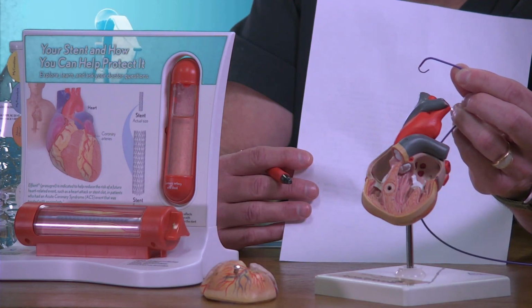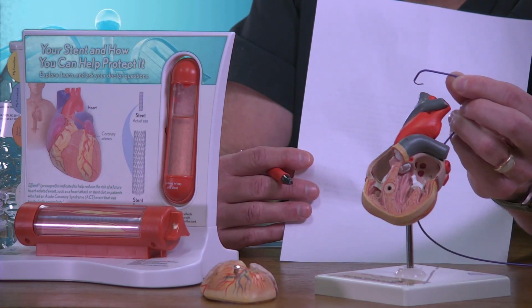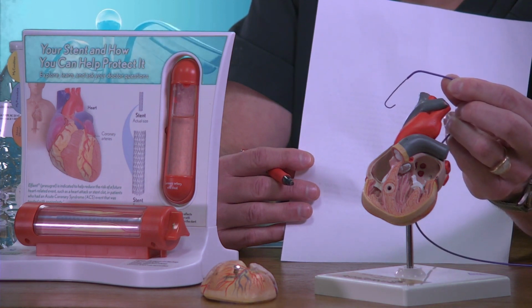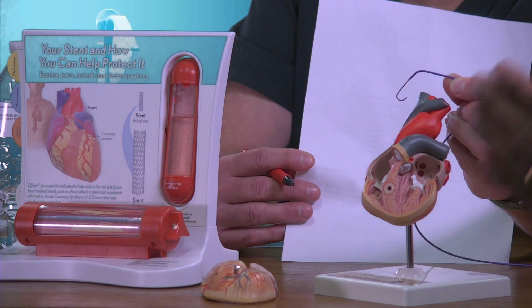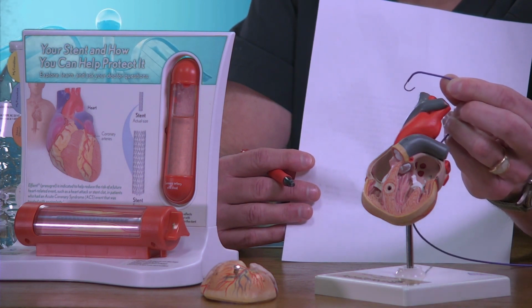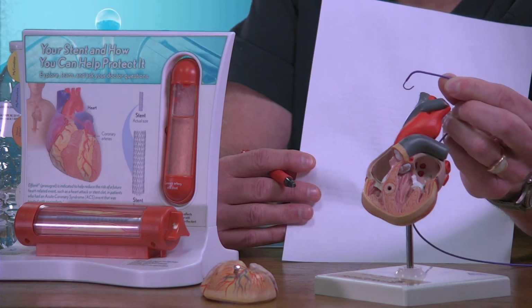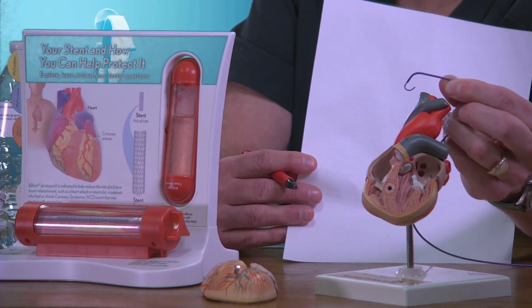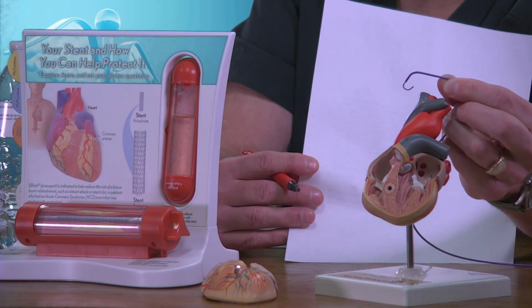So I can, and then we have what we call a torquer here. There's a small device that I can rotate, and I can rotate the tip, and I can make it go 90 degrees this way, 90 degrees that way. So you can really steer this object. Steer it, yes. Anywhere you need to go, because the arteries do not follow a predictable pathway, and you can follow them, correct? Yes. All right. And then that can take you right up to the blockage. Right up to the blockage.